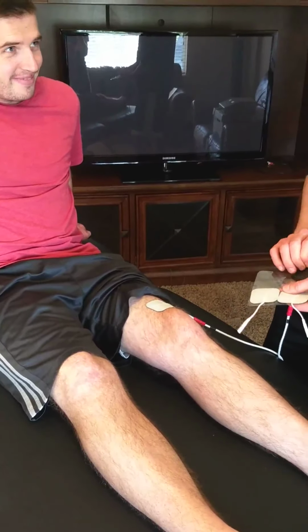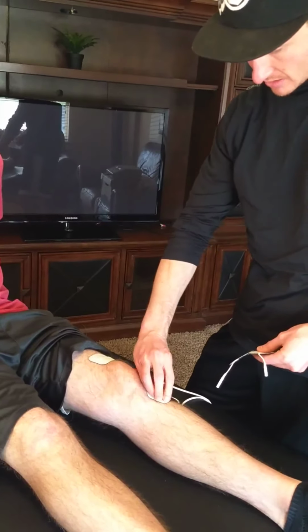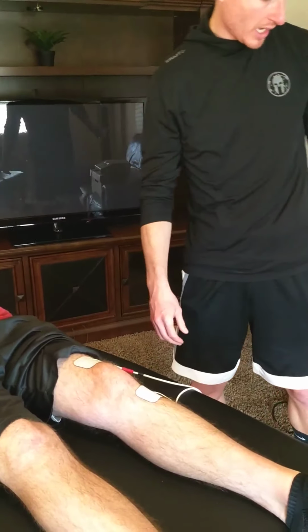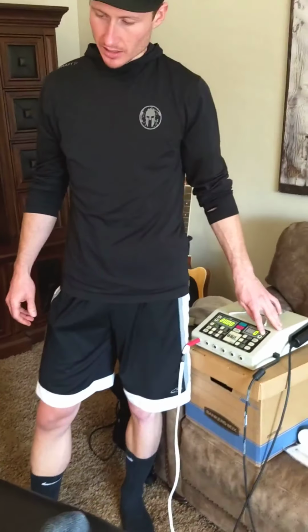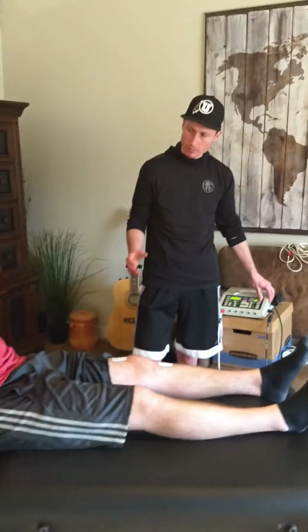Promise. Just sitting out. Okay, awesome. And again, you should feel some tingling with this, but no pain or heat or anything that way. So I'm just going to gradually start this, Hank, and you let me know when you start to feel it, and then eventually we'll get it to where you want it to get to where it's strong but not uncomfortable for you.